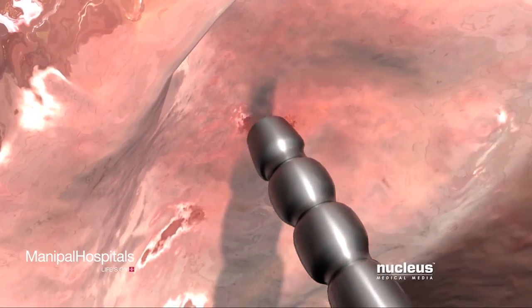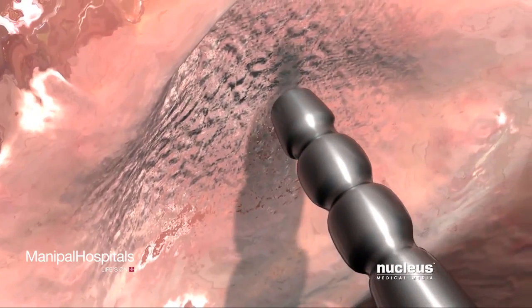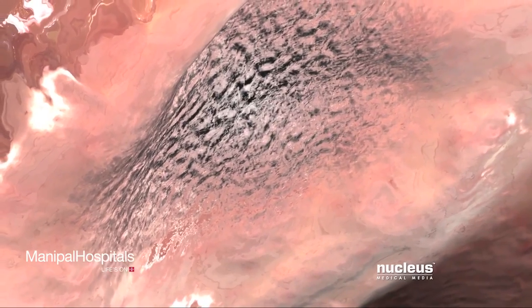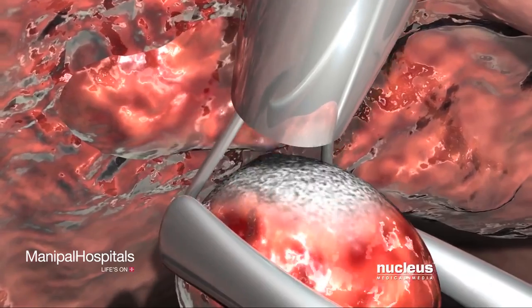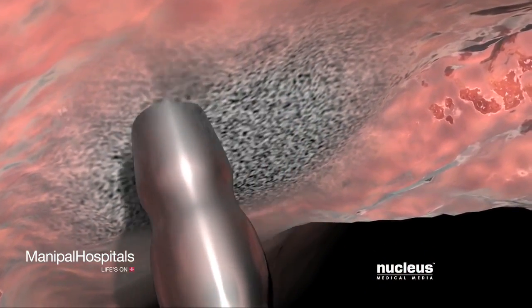Electrocauterization or clamps and ties will stop any bleeding at the site where the tonsils were removed. This area generally heals naturally without stitches. The procedure for an adenoidectomy is very similar to that for a tonsillectomy. Both procedures can generally be done in 20 to 60 minutes.